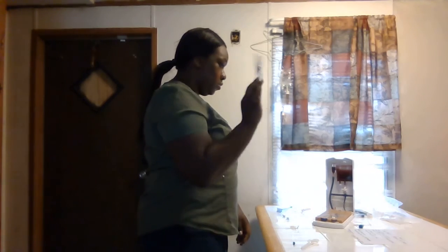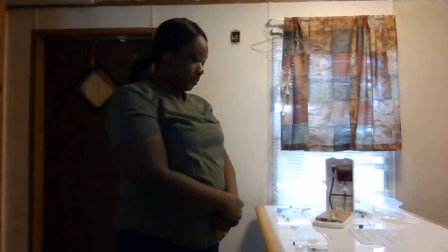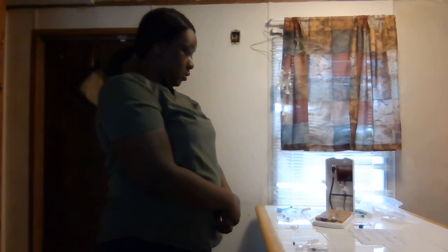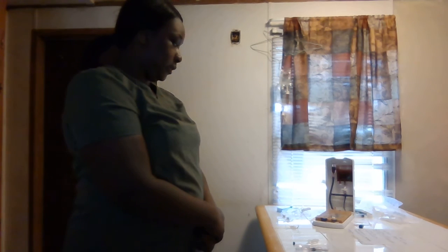We're going to use our 3 ml saline flush, priming it to remove the air. Once we prime it, we can flush the INT.